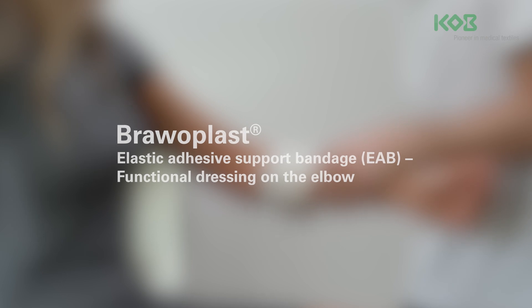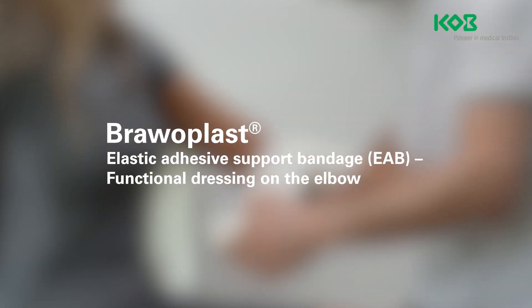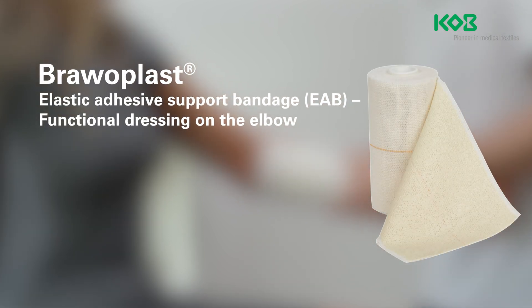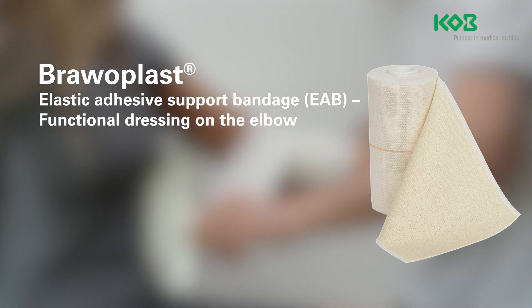The Bravo Plast Elastic Adhesive Support Bandage, known as EAB for short, is made out of 100% cotton coated with an adhesive compound. This adheres the bandage directly to the skin, providing a secure hold for the dressing.